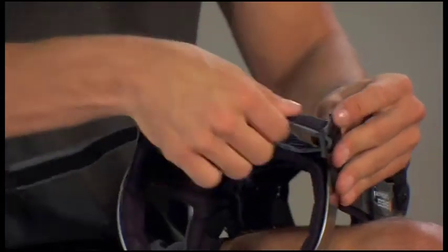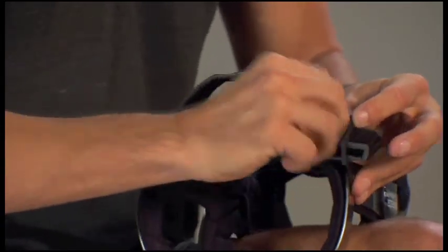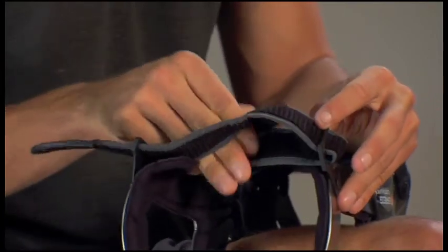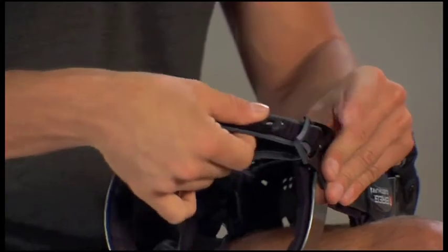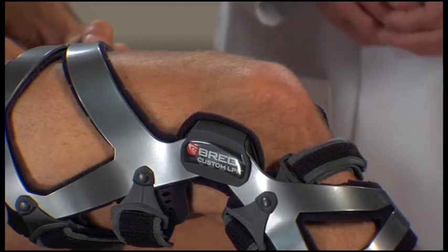LPR knee braces are designed to be easy to use, but there are a few tips that might help with fit and comfort. If the straps are too long, adjust them accordingly. You may find that the brace straps stretch after prolonged wear and heavy perspiration. Make sure to err on the side of placing the hinges further back on the knee rather than too far forward — this will help ensure the brace stays in the correct position during the strapping process.